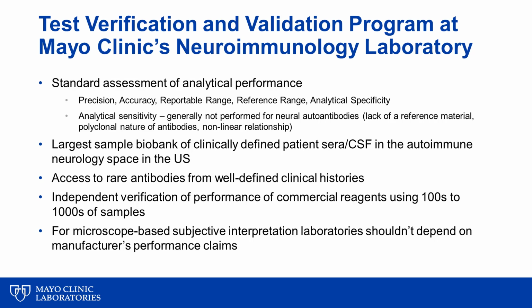This is aided through access to a large biorepository of specimens that can be utilized for these verification and validation studies. This is particularly important for assays that utilize subjective microscope-based interpretation.